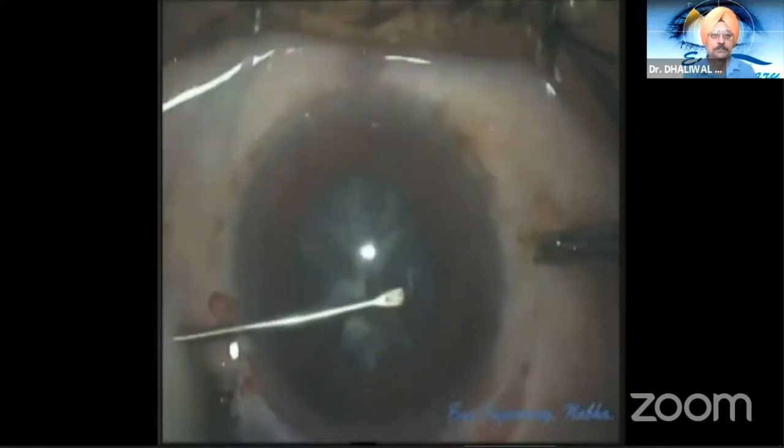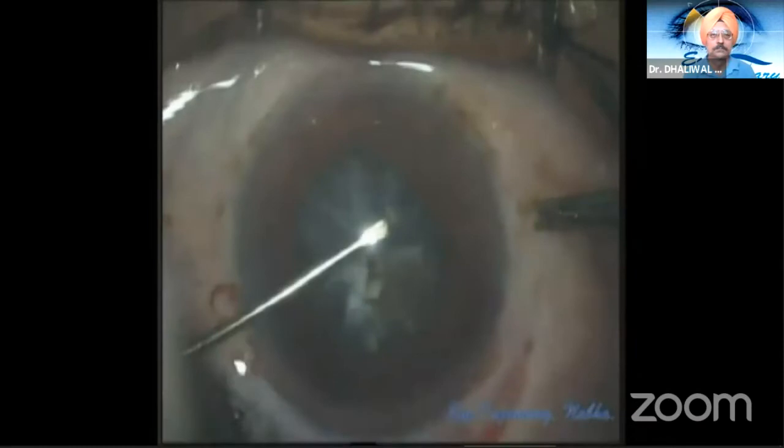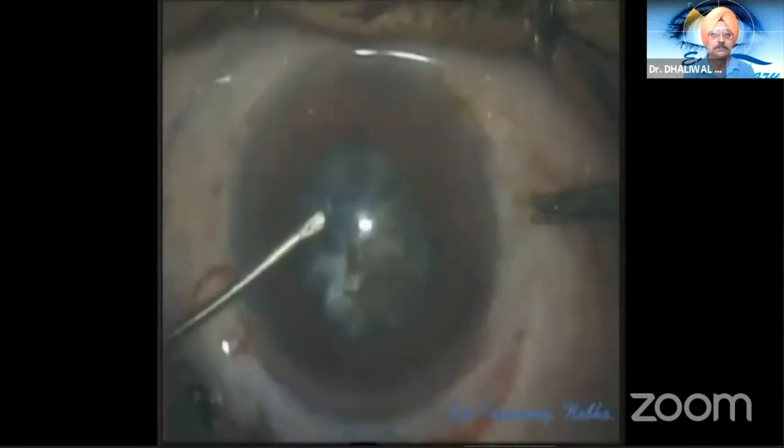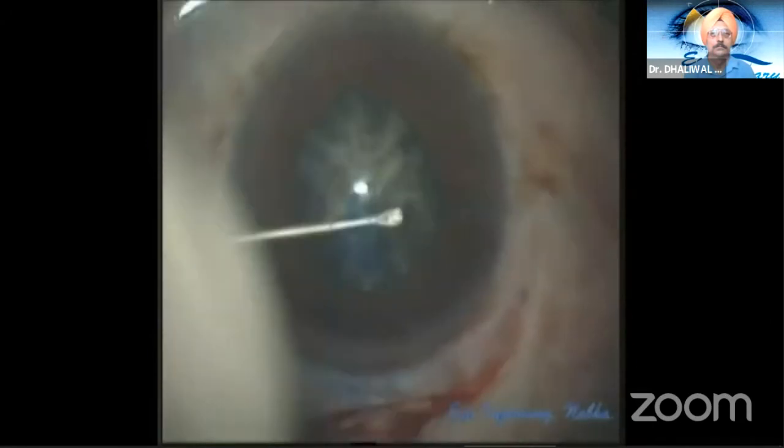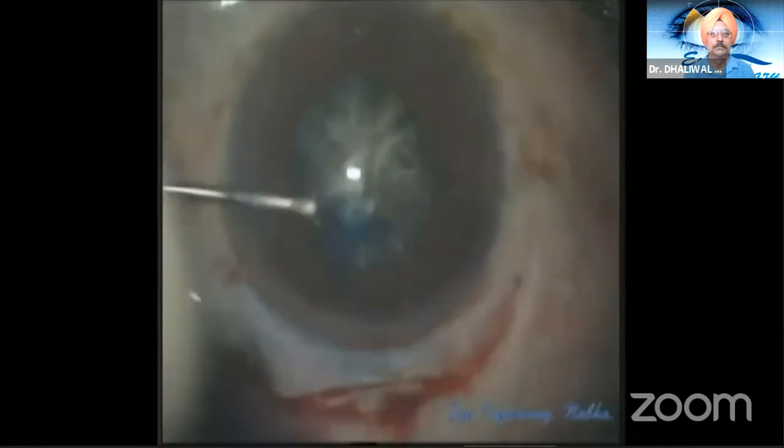Closed chamber circular curvilinear capsulorrhexis is performed, and keeping in mind the size of the nucleus, radial nicks are given all around the rhexis margin. The AC is then entered with a 2.8 mm keratome.